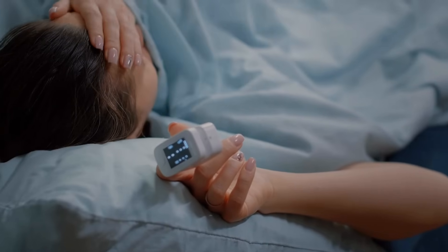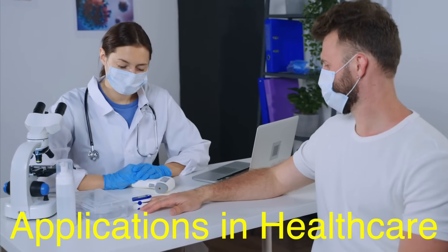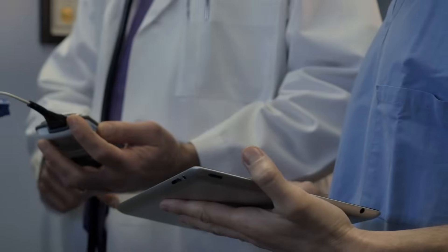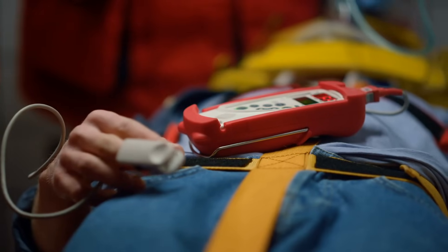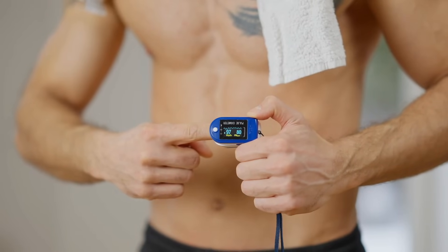That said, for most day-to-day applications — like monitoring a respiratory condition at home or assessing fitness levels during exercise — they're remarkably dependable. Pulse oximeters aren't just for people at home keeping tabs on their health; they're critical in clinical settings too. Doctors and nurses use them in hospitals to monitor patients undergoing surgery, receiving oxygen therapy, or battling respiratory illnesses. Paramedics rely on them to assess a patient's condition during emergencies. They're also common tools for pilots and mountain climbers, where low-oxygen environments can pose significant risks.